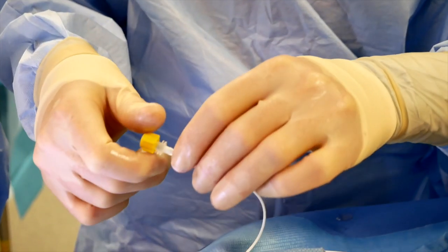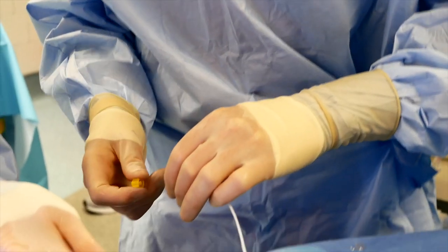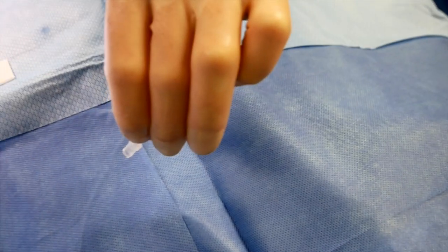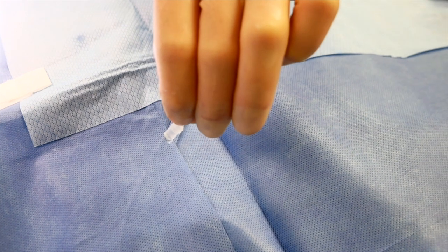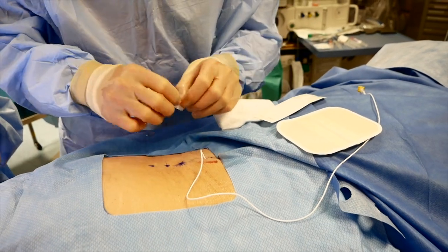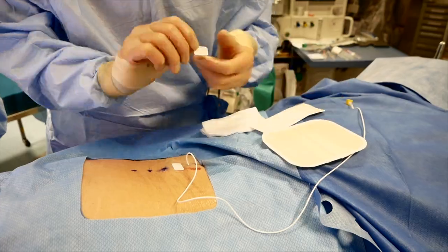Clear CSF output should again be observed with removal of the yellow cap. The lumbar drain is now dressed.